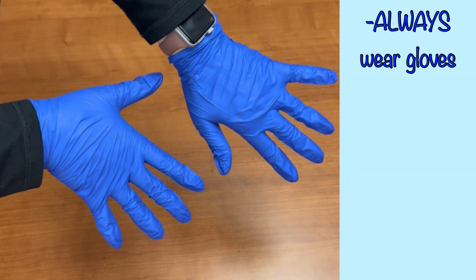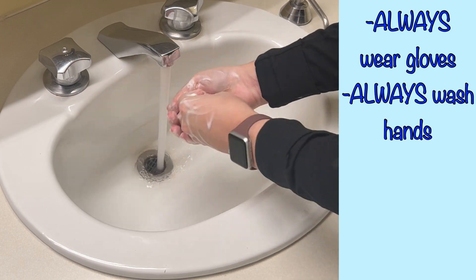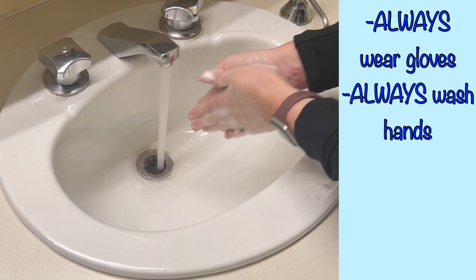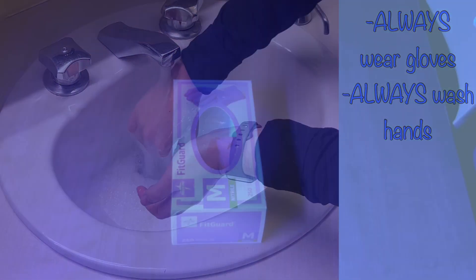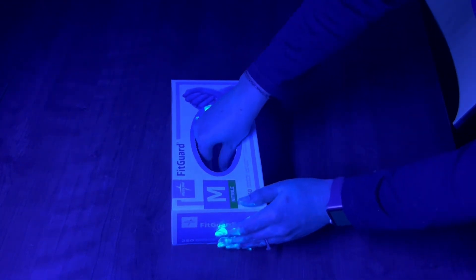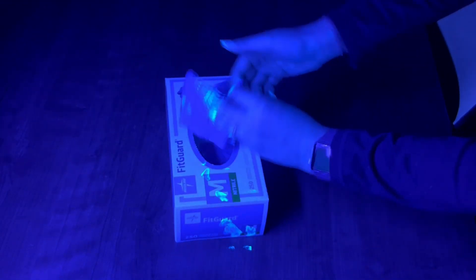Gloves should always be worn when in contact with a patient. Before donning gloves, always wash or disinfect your hands, which you should be doing any time you walk into a room. You don't want to risk contaminating the box or other gloves if your hands are already carrying contaminants.